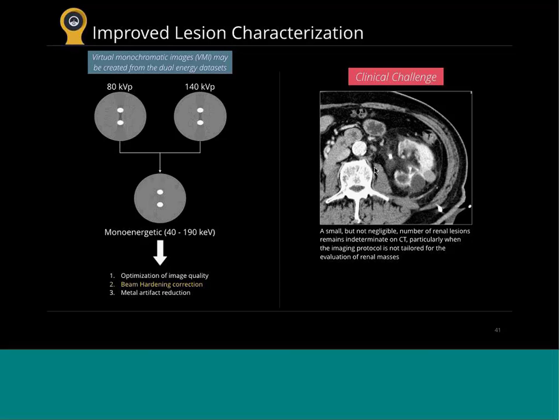This is what happens to us all the time. So this is a patient who, let's say, came in for abdominal pain. Okay, this can happen today. You can see this patient on the flash today, for example. They get scanned for abdominal pain. They get contrast, portal venous phase only, right? Of course it's portal venous phase because it was for rule out appendicitis or rule out diverticulitis. We're not doing anything else.